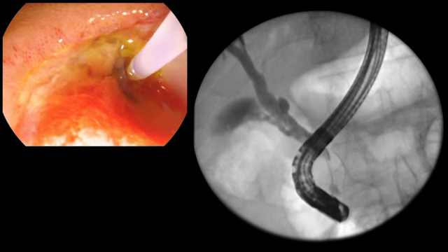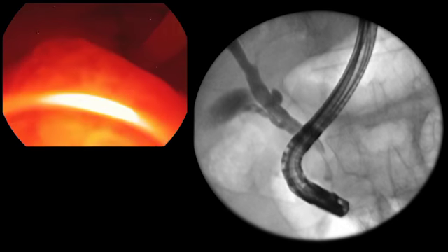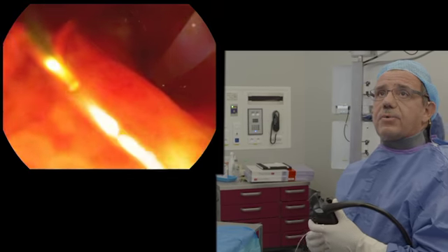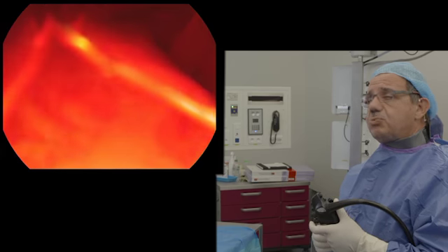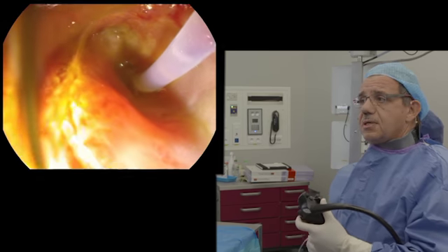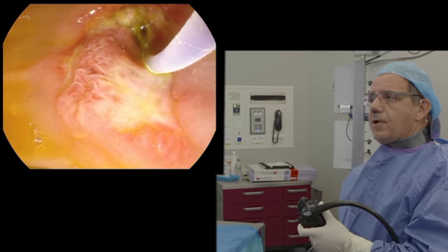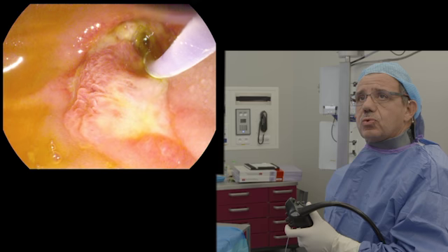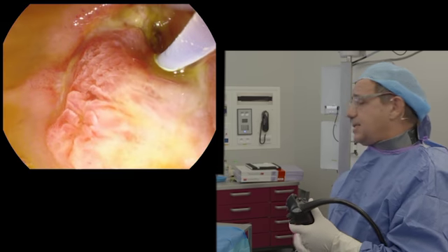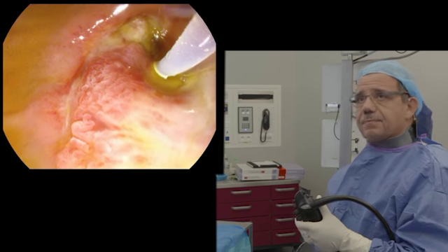Voilà. There is a long stenosis. It is a 2 centimeter stenosis with infiltration of the bile duct. And I think this is an extension of the ampullary lesion to the bile duct, or it's a cholangiocarcinoma of the lower part of the bile duct with infiltration of the papilla.